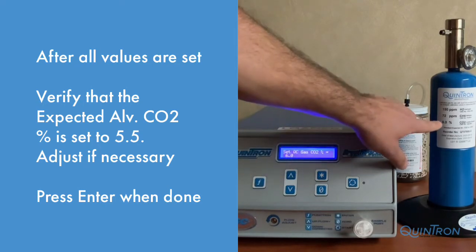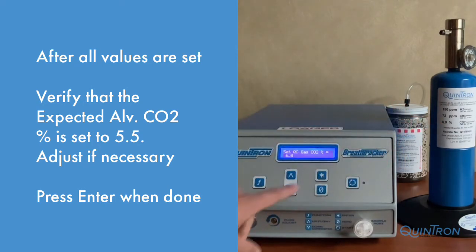After you have finished setting all three gases to match the gas tank, you will be prompted for Expected Alveolar CO2%. This is defaulted at 5.5%. Adjust if necessary, but if not, press the Enter key to access the Cal Ready screen.